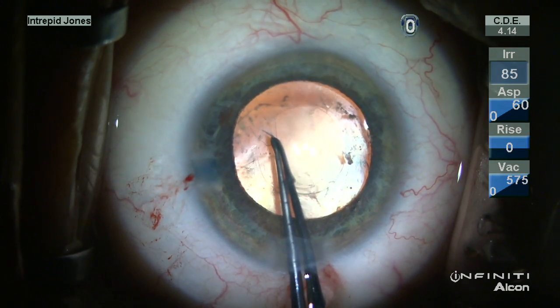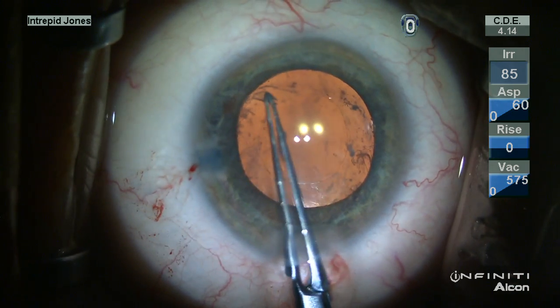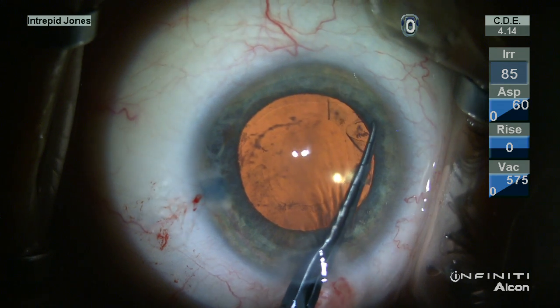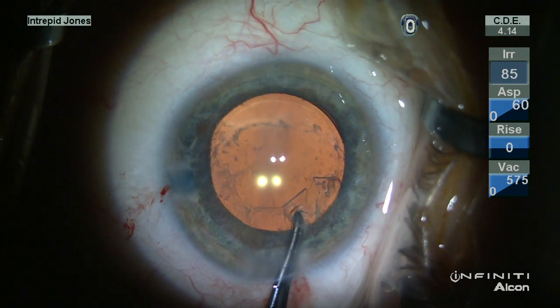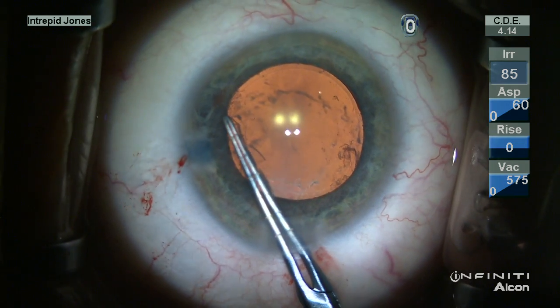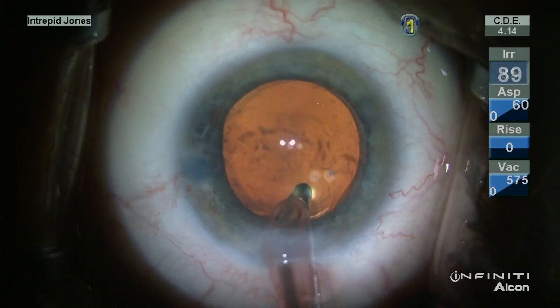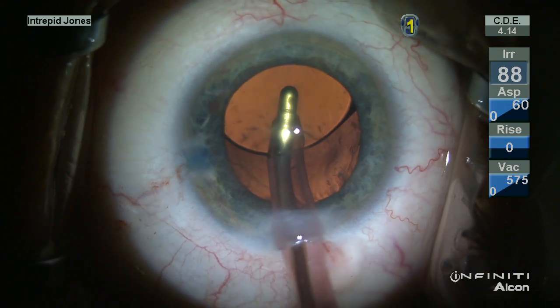This small capsulotomy is enlarged carefully using a hypodermic needle to incise the rim, and then Utrata forceps to carefully manipulate this opening larger. This is an important step in order to prevent anterior capsular phimosis, which can lead to decentration of the intraocular lens and if extensive may preclude good vision.